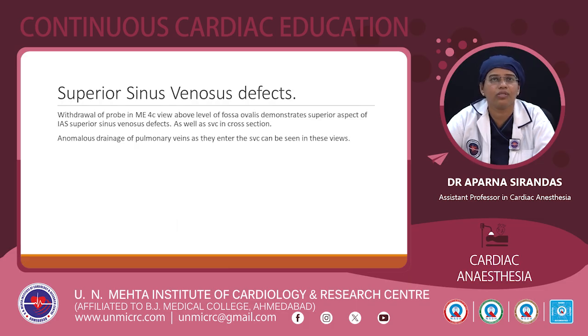Superior sinus venosus defects. Withdrawal of the probe in the midesophageal 4-chambered view above the level of fossa ovalis demonstrates the superior aspect of the interatrial septum, superior sinus venosus defects as well as the SVC in cross section. Anomalous drainage of the pulmonary veins as they enter the SVC can be seen in these views.